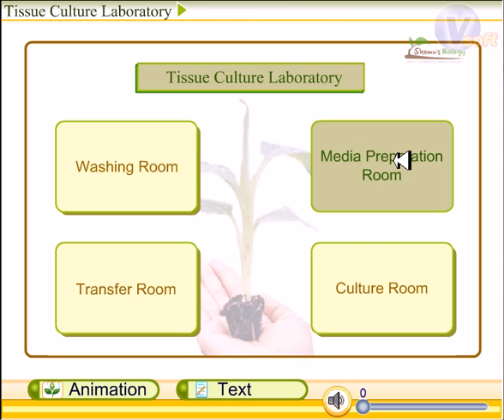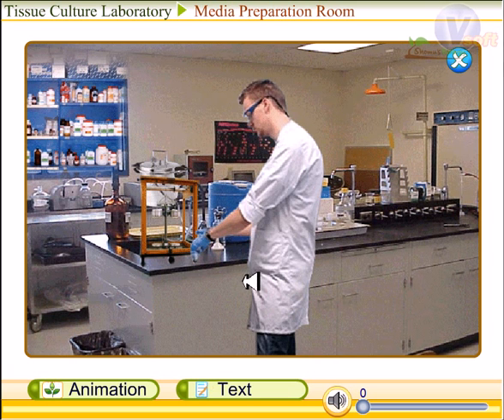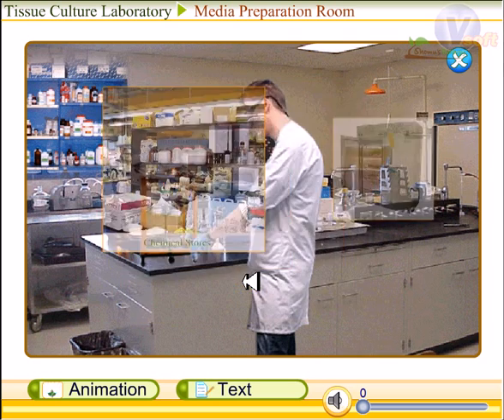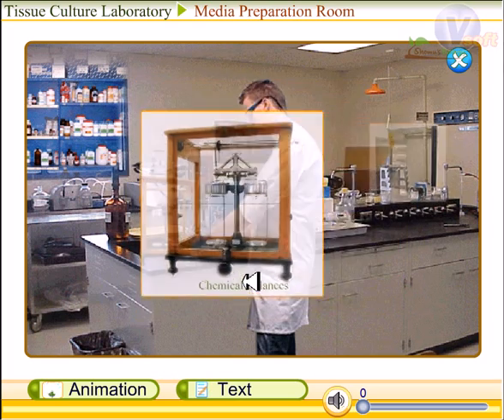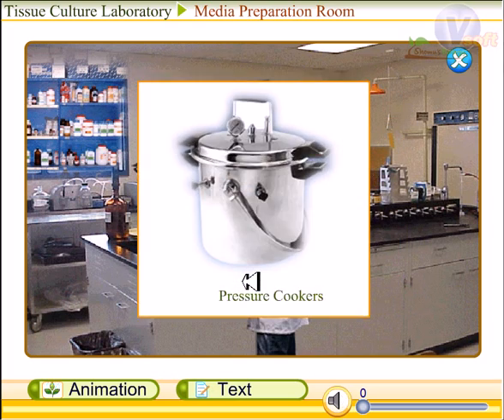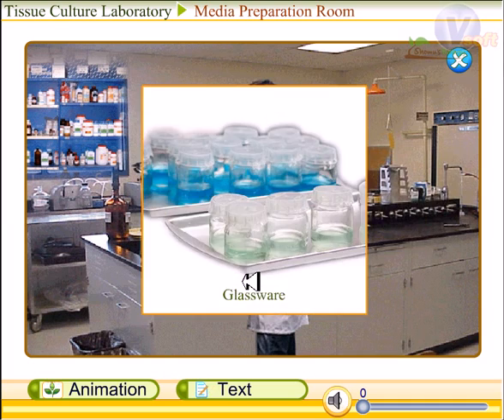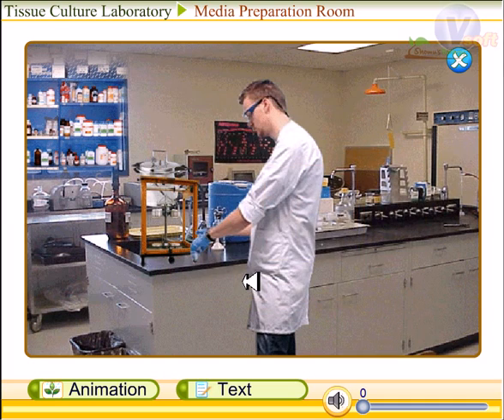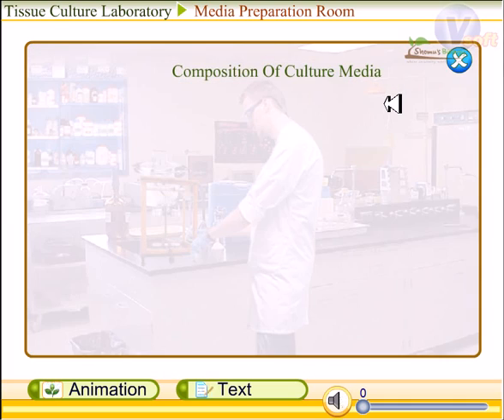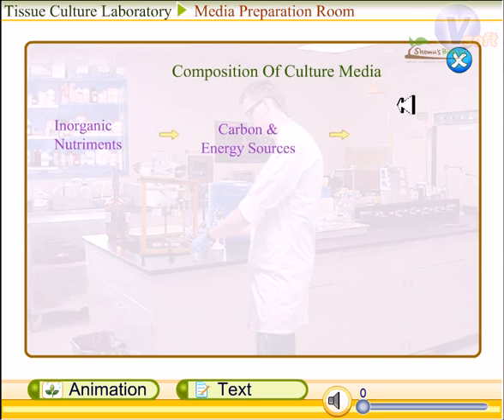Now we will look at the media preparation room. All preparations of culture media required for tissue culture are done here. This room should have all necessary items such as chemical stores, freezers, chemical balances, pressure cookers, pH meters, and the required glassware.